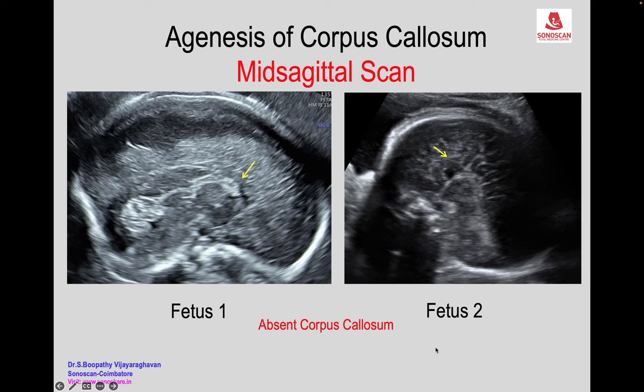In both fetuses there is absent corpus callosum, as shown by the arrows. In fetus two, another sign of agenesis of corpus callosum — namely the radiating sulci — is seen, because the cingulate sulcus is not developed and other sulci are radiating, which is visible in fetus two.